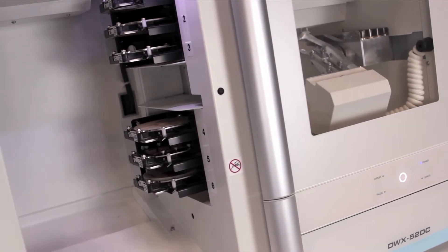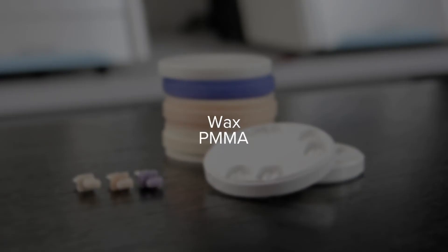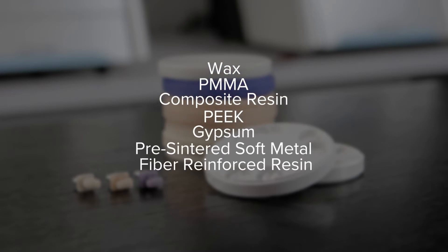This dry mill features a six-slot automatic disc changer that empowers you to assign multiple milling jobs using a variety of materials, such as wax, PMMA, composite resin, PEEK, gypsum, pre-sintered soft metal, and fiber-reinforced resin.